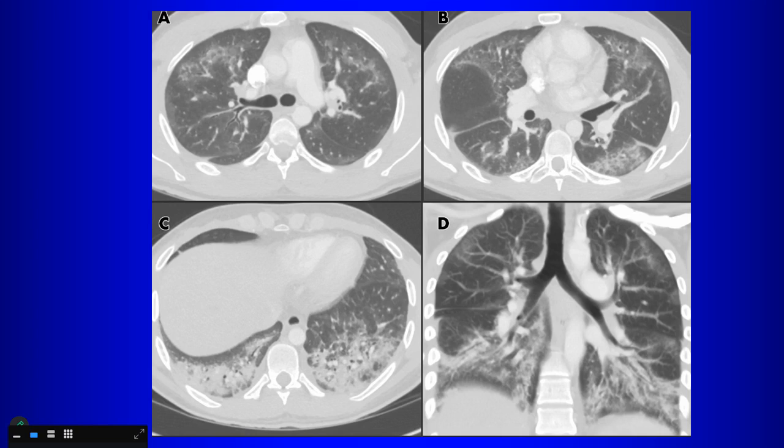Although pulmonary edema is not typically peripheral, that tends to be more perihilar. Atypical pneumonia can be anywhere, but doesn't have a typical peripheral distribution. Except there is one type of pneumonia that does have a peripheral distribution. What pneumonia is that?